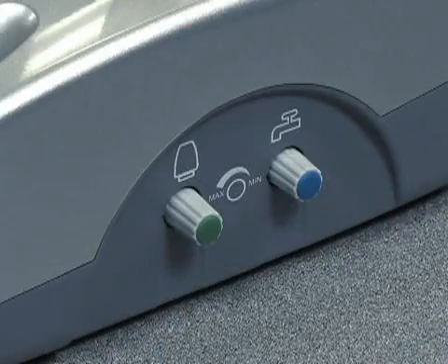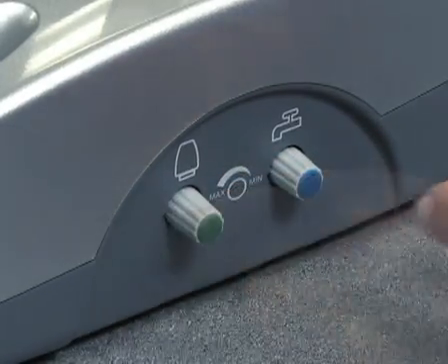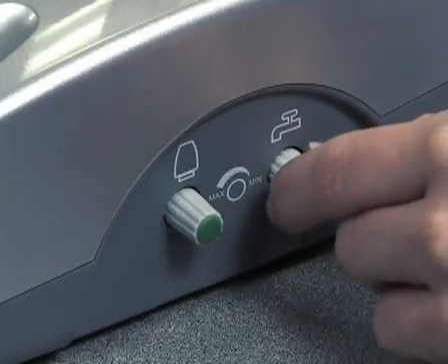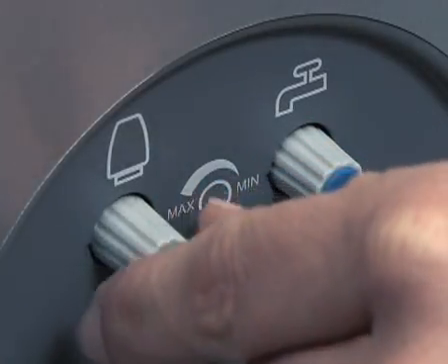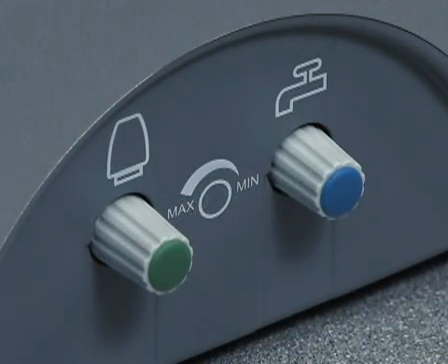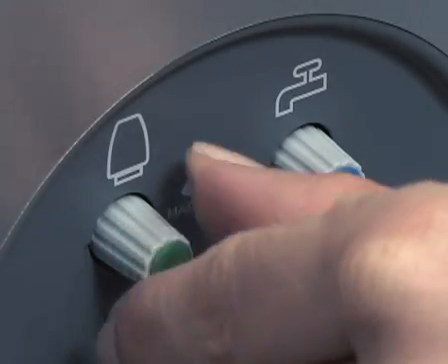There are two water adjustment knobs, each corresponding with a water mode, as indicated by the icon adjacent to the knob. One adjustment knob controls water flow for the irrigation bottle mode, and the other adjustment knob controls water flow for municipal water mode. Rotate the appropriate water adjustment knob counterclockwise gradually to increase the water flow. To decrease water flow, rotate the water adjustment knob clockwise.